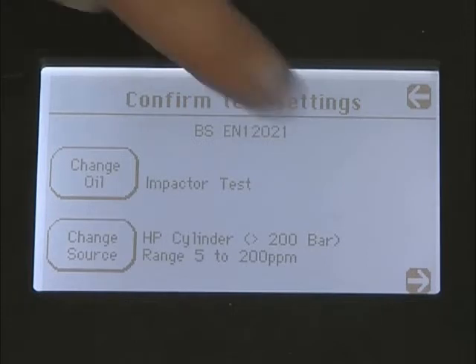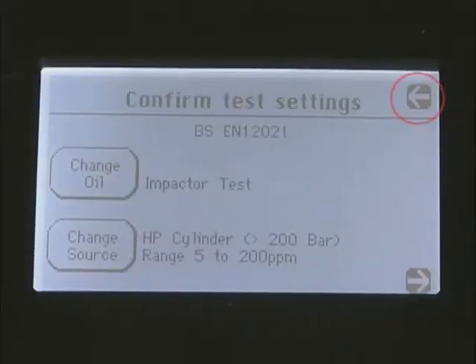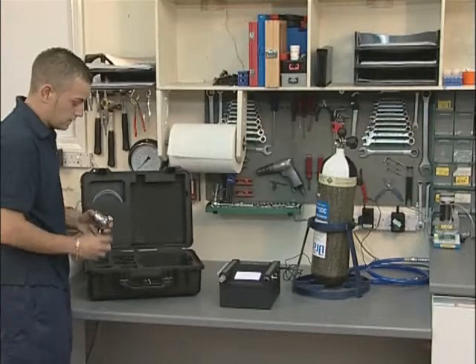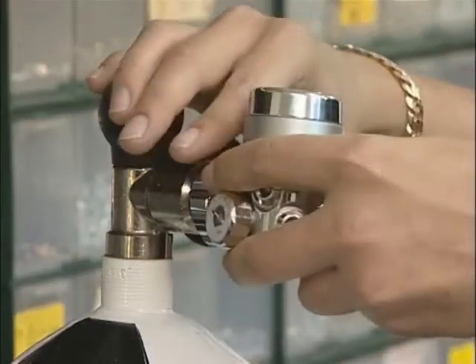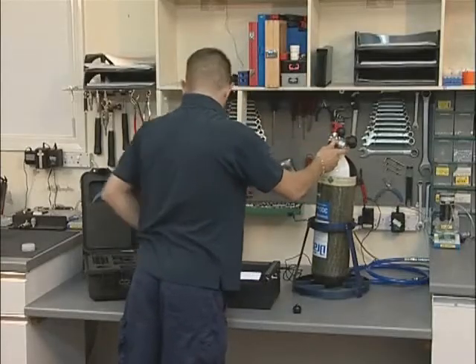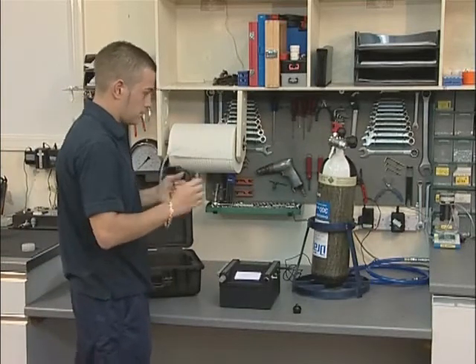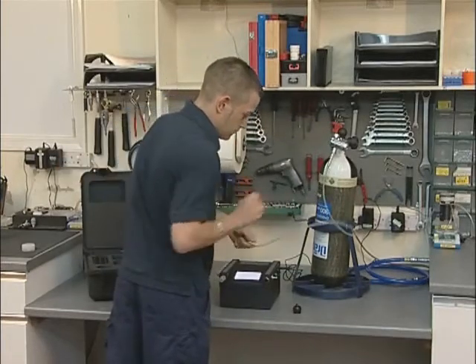Confirm that all settings are correct by pressing the right arrow key. If settings are not correct, press the left arrow key and repeat the previous procedures. Connect the high pressure regulator assembly to the cylinder to be tested, ensuring that the regulator has the correct type of connector for the cylinder. Connect the regulator hose coupling to both the regulator and the inlet of the tester.